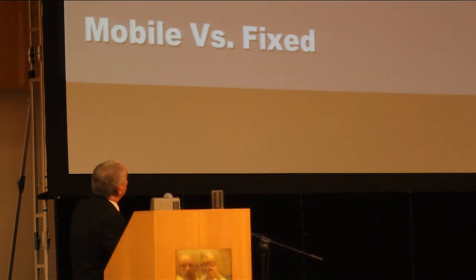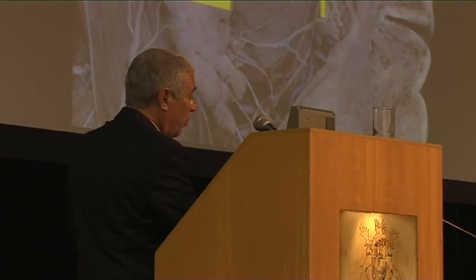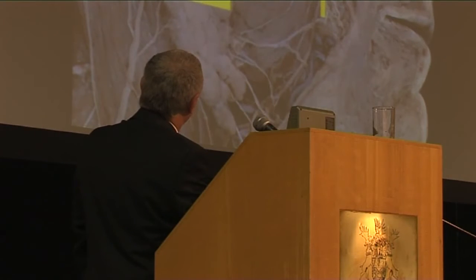The major factors affecting the sialolithotomy procedure are the location, anterior, middle, or posterior, the stone diameter, and mobile versus fixed stones. Other factors are duct diameter and stone configuration. The location is the most important factor. Diameter and mobilization will dictate the surgical technique.